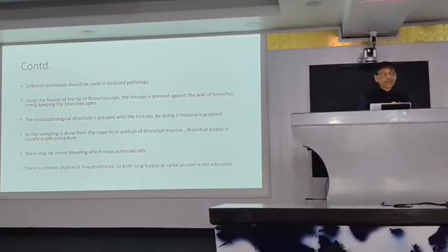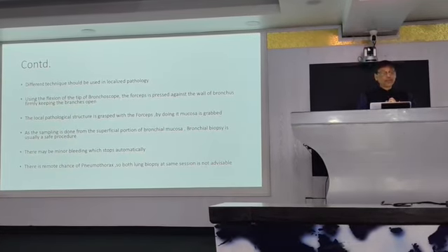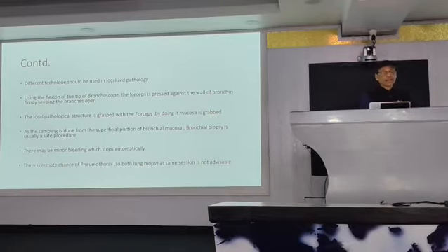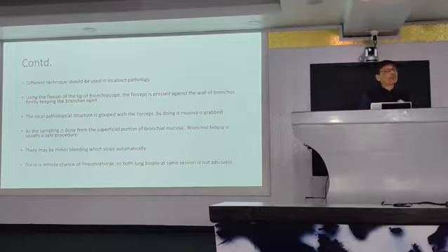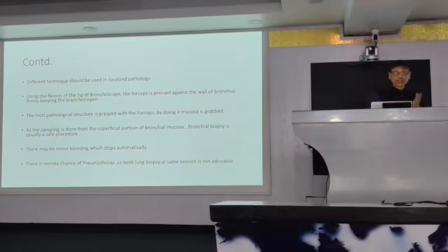As the sampling is done from the superficial portion of bronchial mucosa, bronchial biopsy is usually a safe procedure because it is done on the superficial layer. There may be minor bleeding which stops automatically. So if there is a minor bleeding, don't worry, it will stop automatically.